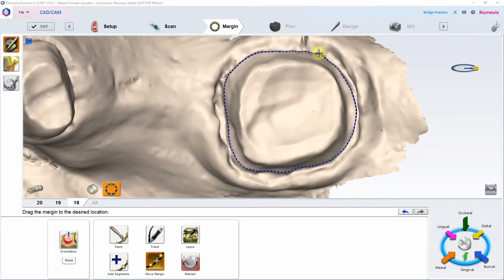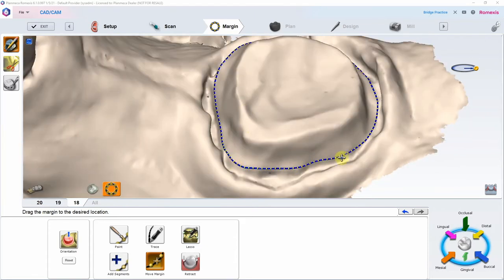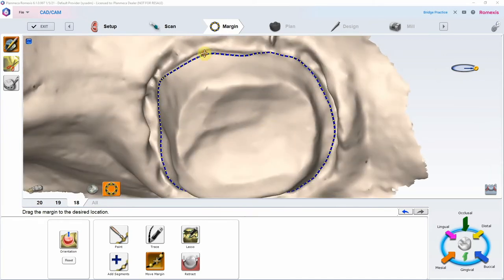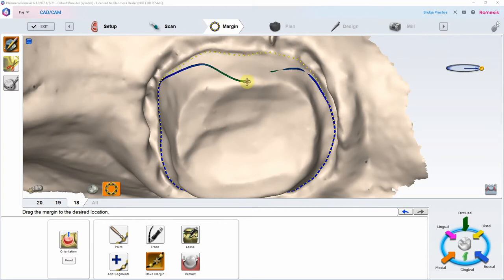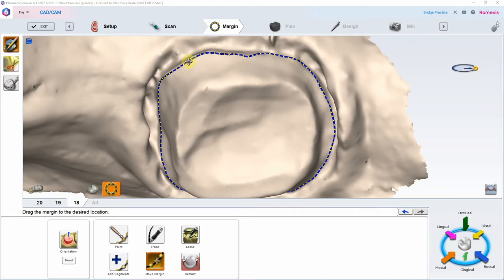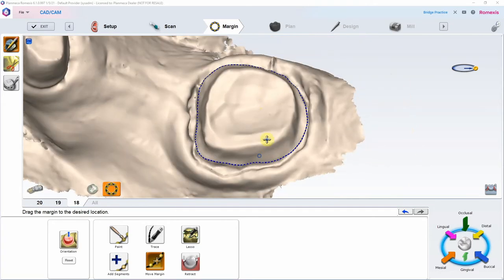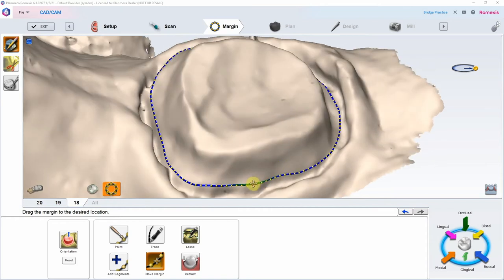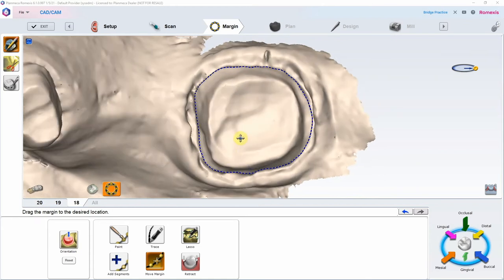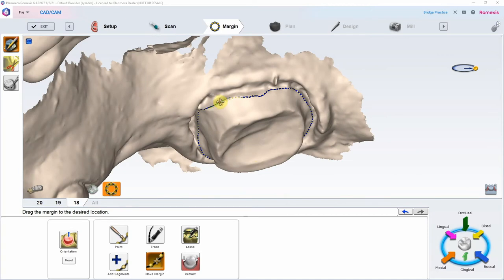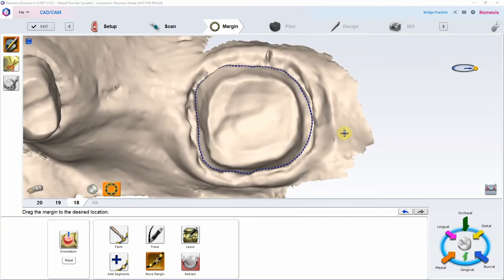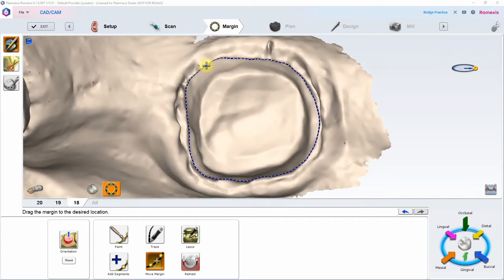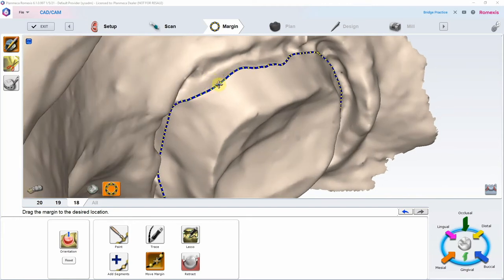Once you use Trace and complete the circle, you'll have the ability to drag the margin using the Move Margin tool. Move Margin is very powerful — using the dropper icon you can move a lot of the margin, or just a little. The default is usually pretty good. Once the margin is marked, look down and see if you can see all the yellow balls all the way around. If not, you've fallen into an undercut and should drag it back up, because it will mill and chip that 100%.